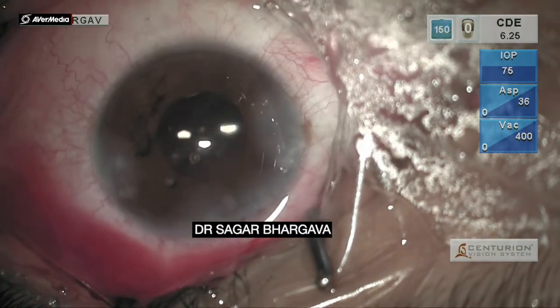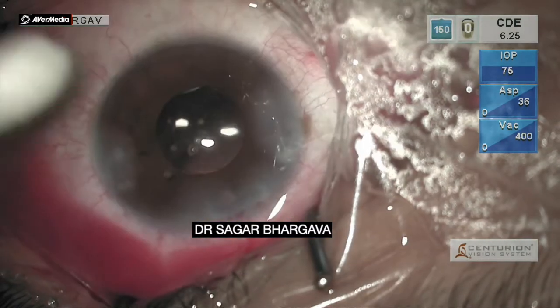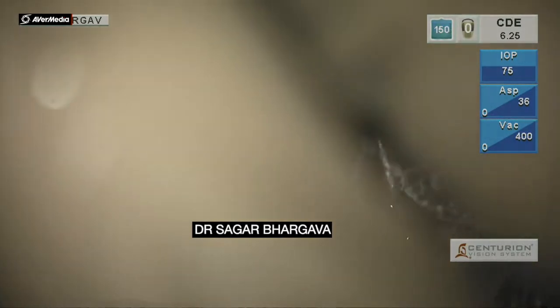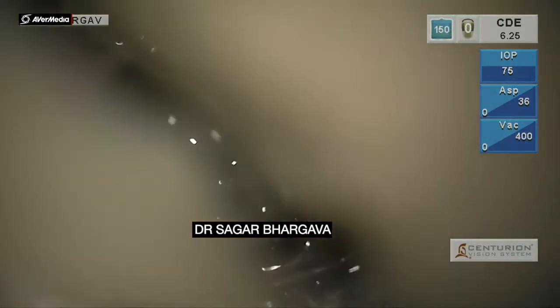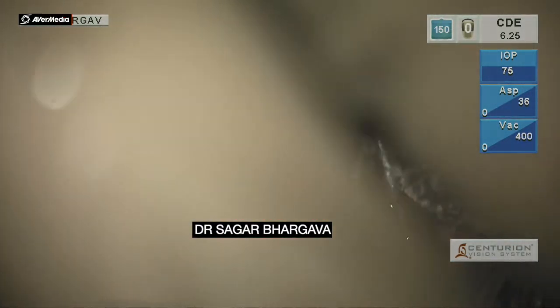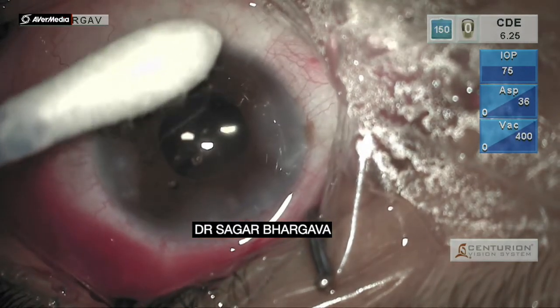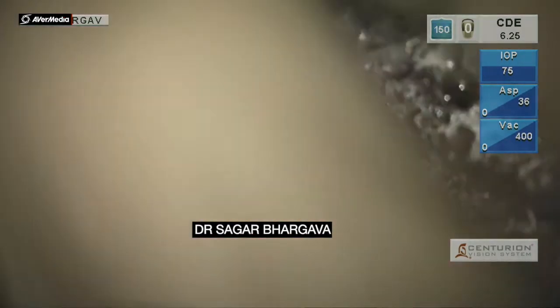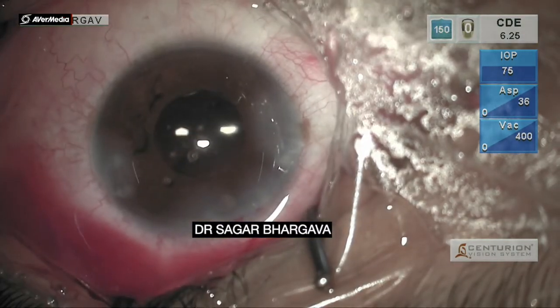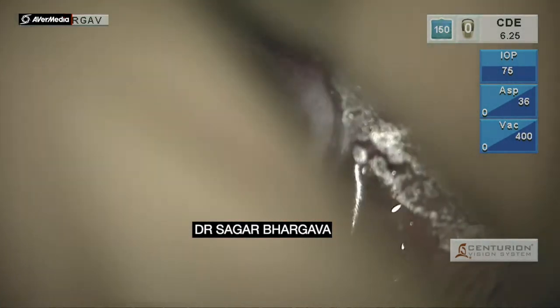IOL exchange is a procedure that can be done even up to 1 to 1.5 years post cataract surgery. The key is to be wary of the degree of fibrosis that has occurred between the anterior and posterior capsule, and one has to be very slow, cautious, and deal with this fibrosis gradually and in a controlled manner so that the lens can be freed comfortably and an IOL exchange can be accomplished.